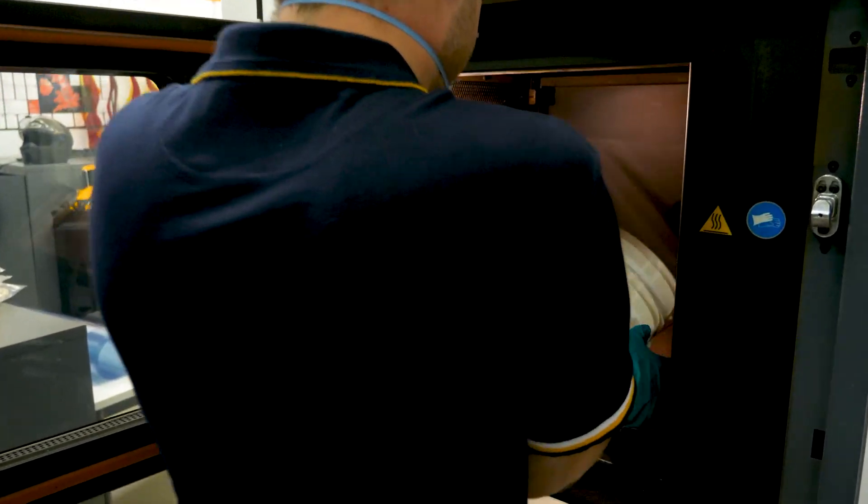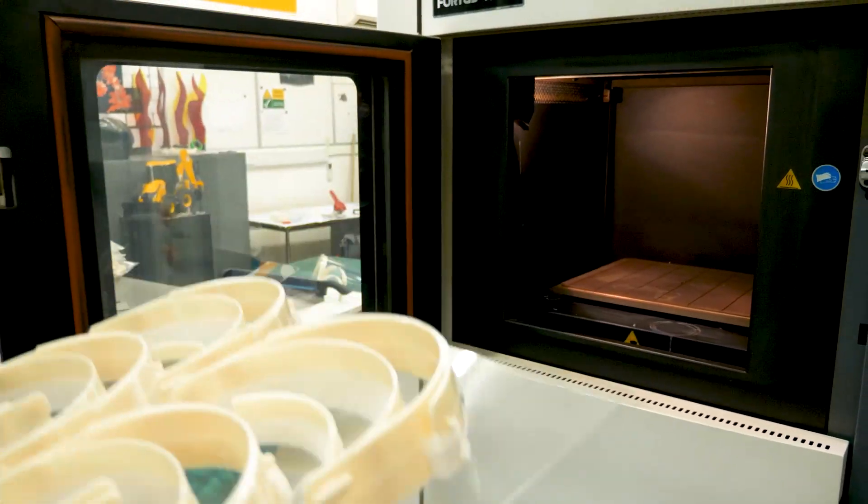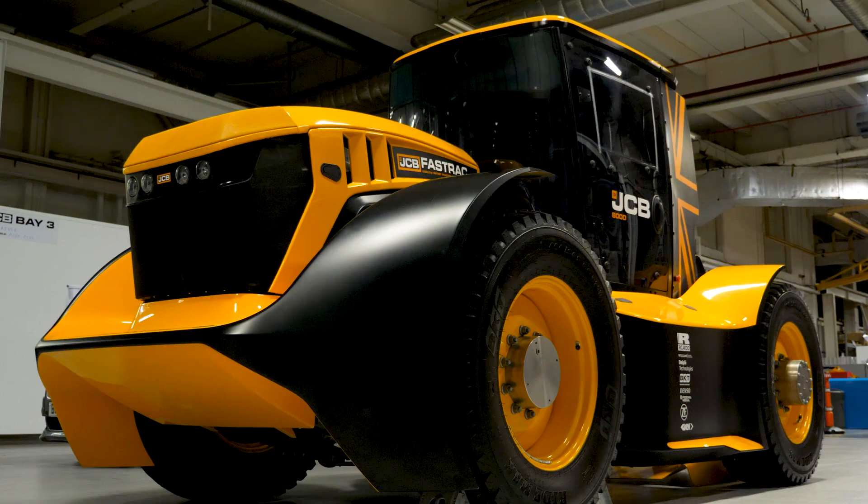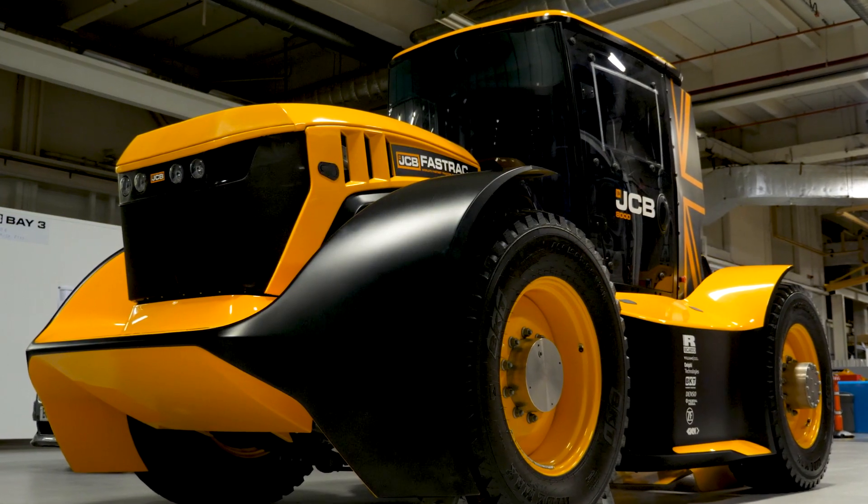The resources we're using to manufacture these headbands are two Stratis FDM machines here in research. We normally use the printers to manufacture one-off large prototype parts, like we do on the world's fastest tractor roof and B-pillars, but we've upgraded them to print medical grade plastic.